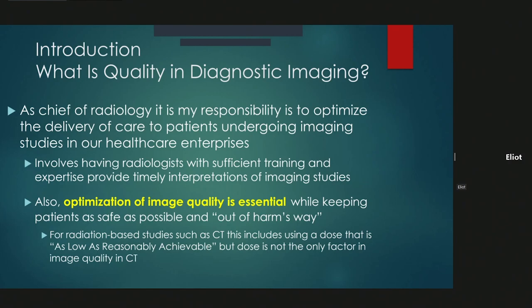And as the chief of radiology, it's been my responsibility to optimize the delivery of care to patients who are undergoing imaging studies in any of our healthcare enterprises. There are so many responsibilities as the chief, including having radiologists that have sufficient training and expertise, providing timely interpretation of imaging studies. But of course, optimization of image quality is essential while trying to keep our patients as safe as possible and out of harm's way. And for radiation-based studies, as you all know, such as CT, this includes using doses that are ALARA, as low as reasonably achievable. But of course, dose is not the only factor in image quality in CT.